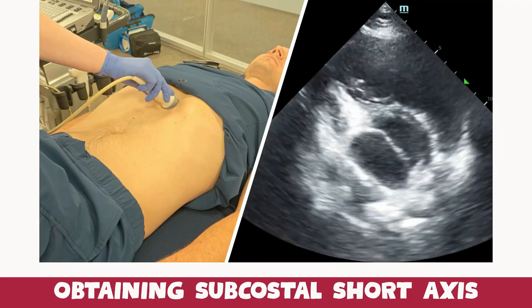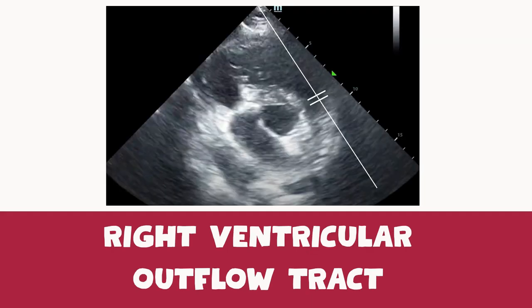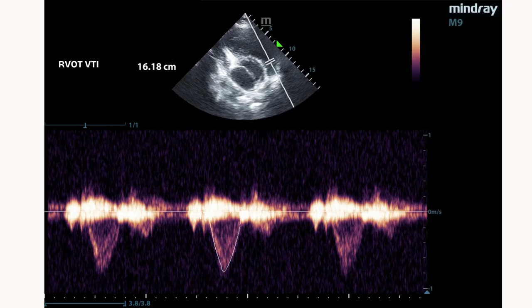We're going at the level of the aortic valve. We have our left atrium, right atrium, right ventricle, and pulmonary artery, with the aortic valve in the center. We place the pulse wave Doppler at the right ventricular outflow tract and the machine gives you the number. We trace the area under the curve — or it might do it automatically depending on your machine. In this patient, the RVOT VTI is 16 centimeters, which is within normal range.